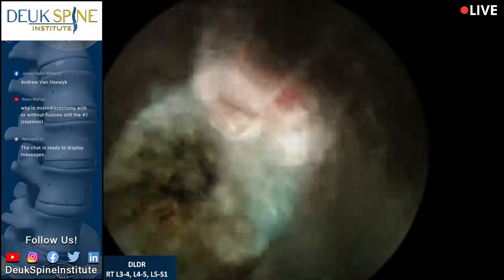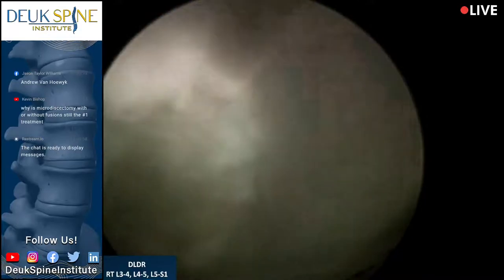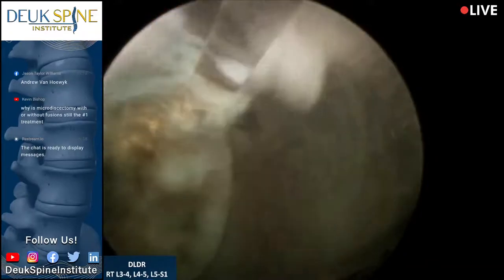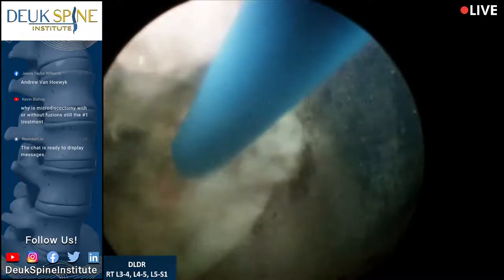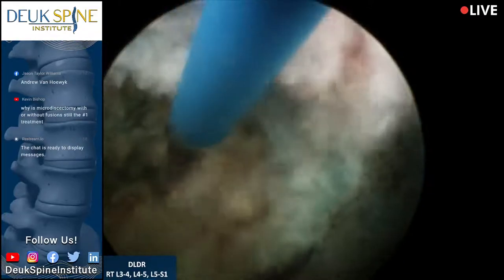We're almost done. You can see the epidural fat right there. And starting to see some fibers of what's called the posterior longitudinal ligament, which tells me I'm nearly done. But we've gone from inside the tear to outside the tear. And I'm using the laser to debride the nucleus pulposus that's degenerated and sitting inside the tear.